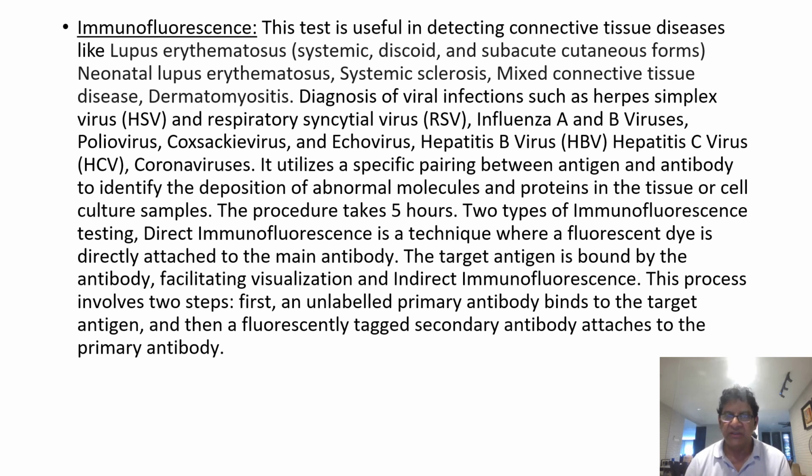But in infectious diseases, it is used in the diagnosis of viral infections such as herpes simplex virus or HSV, respiratory syncytial virus or RSV, influenza A and influenza B viruses, polioviruses, Coxsackie viruses, echoviruses, hepatitis B virus, hepatitis C virus, and coronaviruses. Here it utilizes a specific paired antibody and antigen to identify the deposition of abnormal molecules and proteins in tissues or cell culture samples. This procedure can take up to five hours.